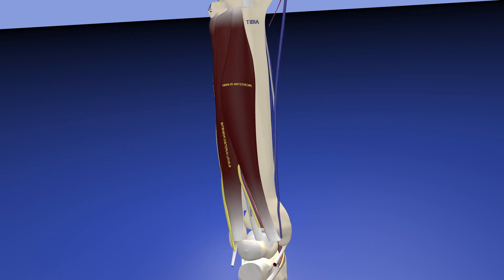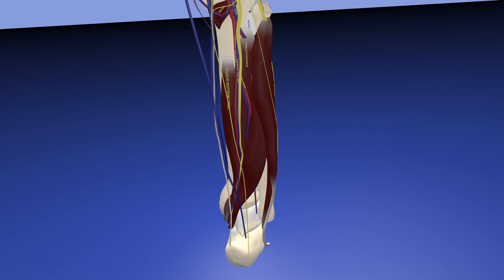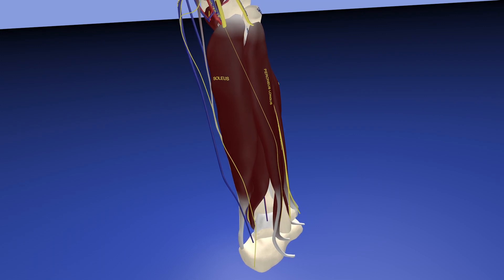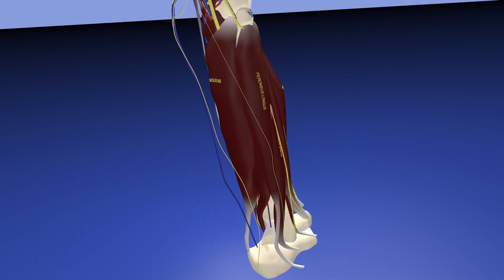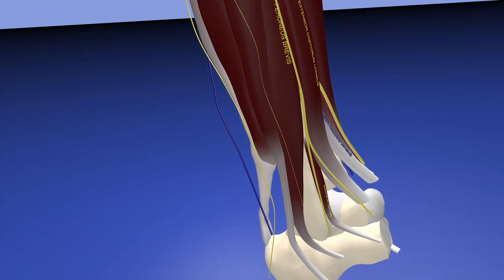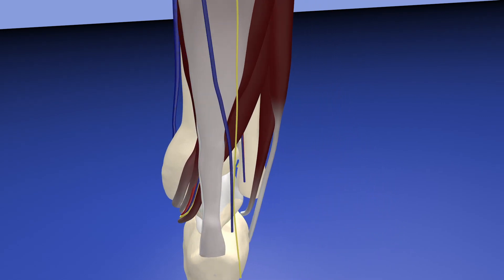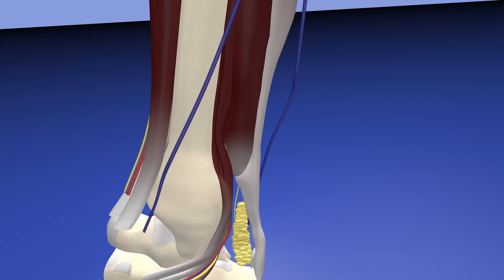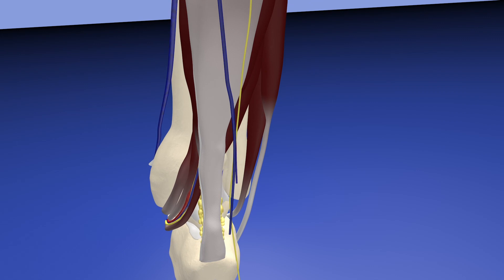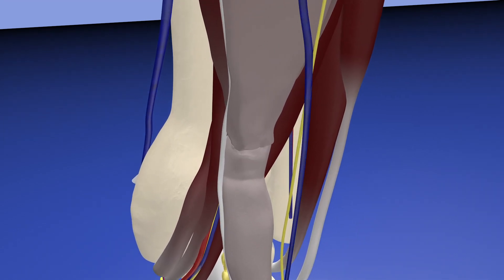Rotating through the views, you can see the anterior compartment, then lateral, and back to our posterior compartment. Here's our soleus muscle, and above that are the medial and lateral gastrocnemius muscles. You can see how the soleus muscle essentially fades into the Achilles tendon and ultimately becomes the medial aspect of the Achilles tendon as it progresses distally. Here's our Kager's fat pad.